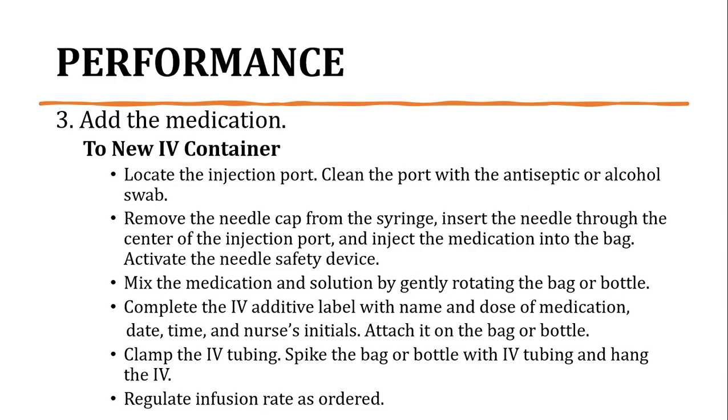Then remove the needle cap from the syringe. Insert the needle through the center of the port and inject the medication into the bag. Activate the needle safety device. I-sure po na natama yung pagkahawak dun sa injection port at tama yung pagkalagay ng syringe para di ma-puncture or mabutas yung intravenous fluid container kasi kapag nabutas yun, magli-leak na yung fluid sa loob.